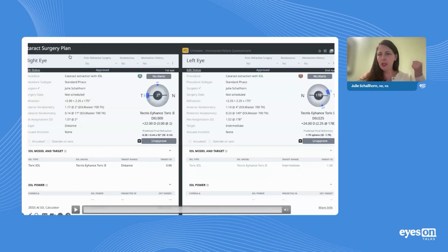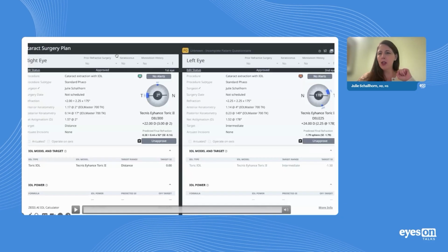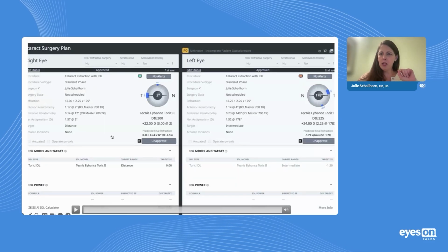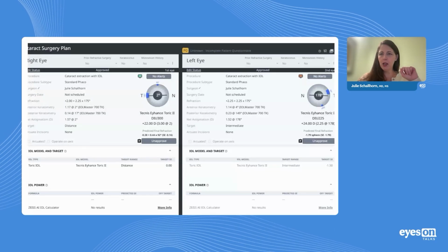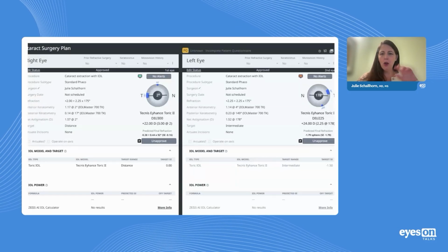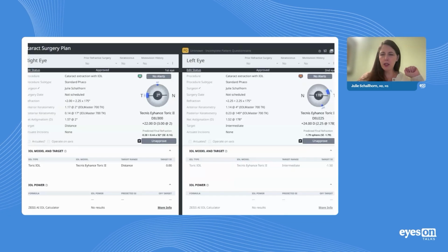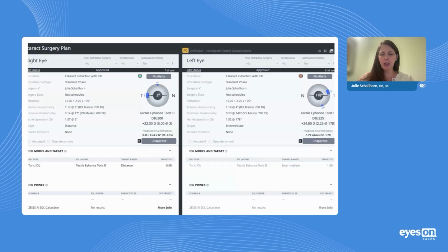They've had hyperopic LASIK. I'm going to put that in, and it pulls up the right calculators. Oh, they have keratoconus. I'm going to put that in, pulls up the right calculators. I'm going to target a little bit of mini monovision for this patient. I'm going to target the distance in their dominant eye and a -3/4 in their non-dominant eye, and it automatically recalculates to that. Oh, I'm going to start using a new IOL. Let me import that, and then suddenly, I'm going to make that my IOL choice, and everything is automatically calculated for that.